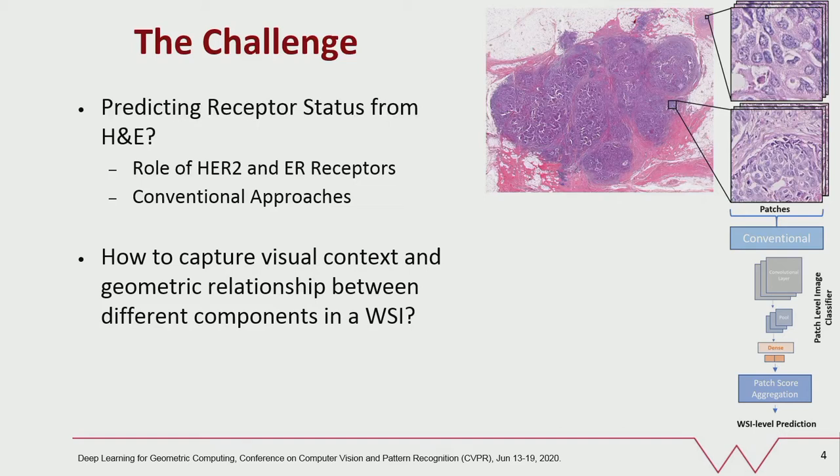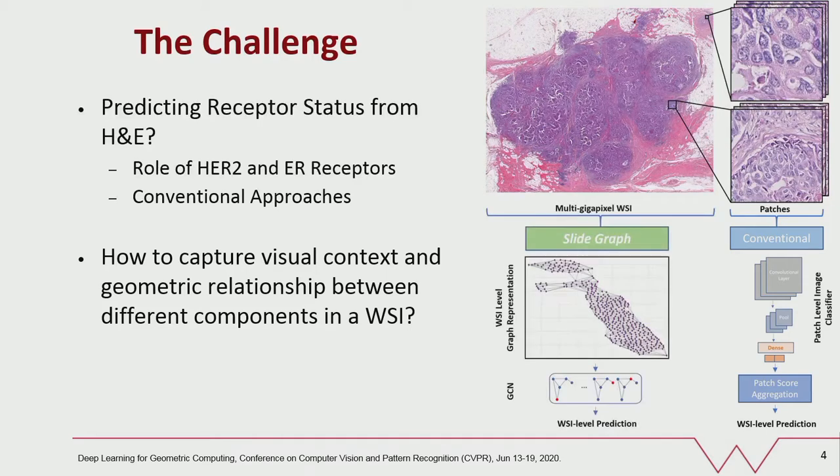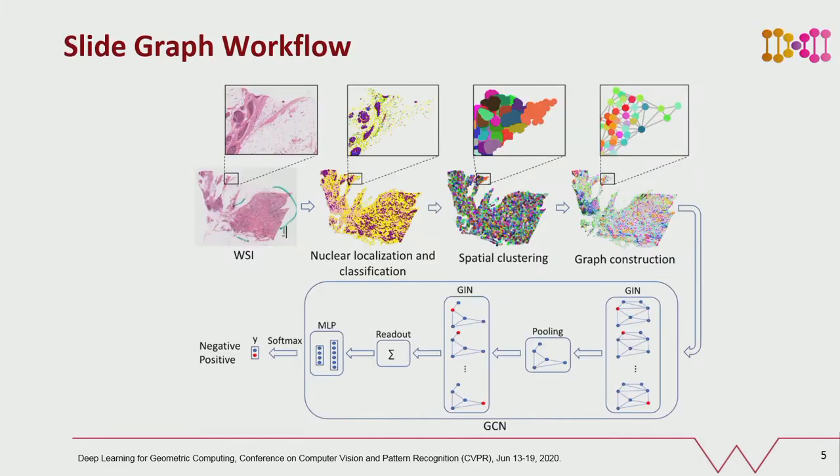We have developed a novel method we call slide graph that overcomes these challenges by modeling a whole slide image as a single graph and using graph neural networks for prediction. This is the workflow of the proposed method.